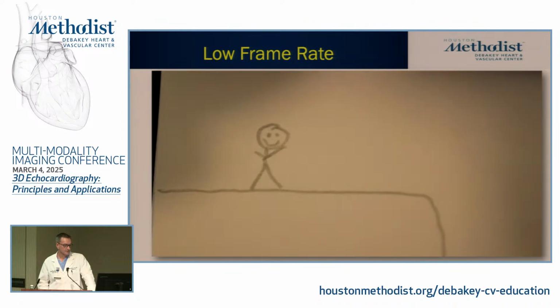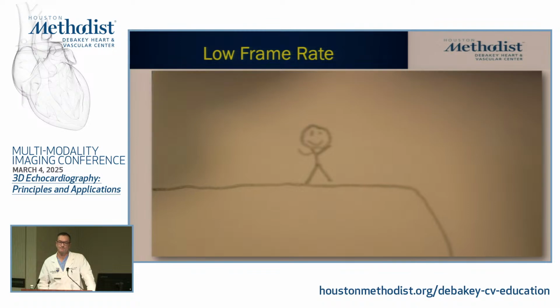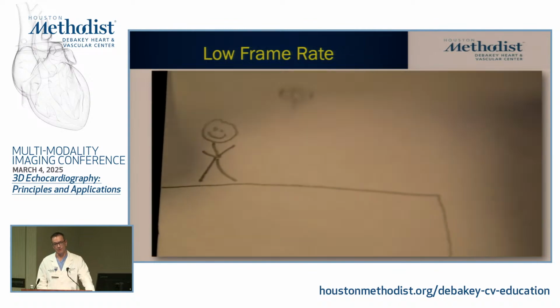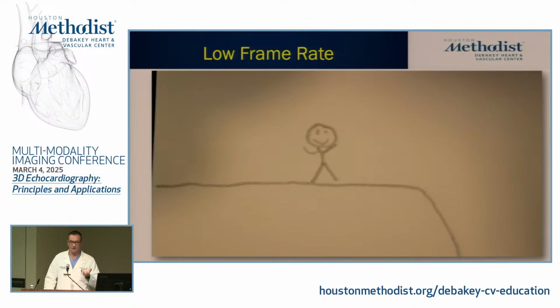But frame rate matters. This is a little cartoon about what happens to this guy at a low frame rate. Maybe it ends well, maybe it doesn't. You don't know. You missed the frame. So this is important for end systole. Did you really get end systole or not? You don't know on a low frame rate.